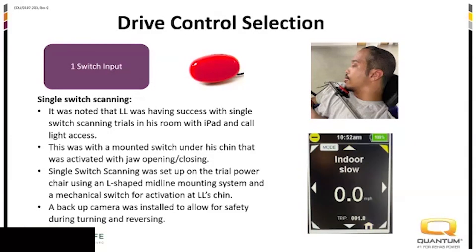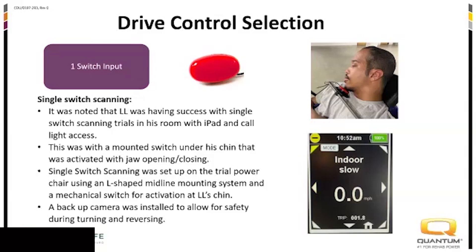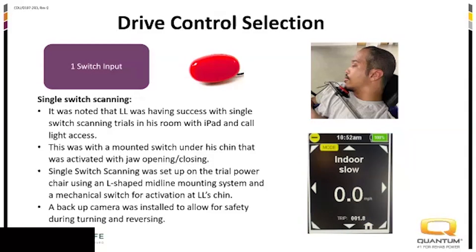We initially mounted — you can see that gray bar that comes out underneath there — a switch there. You can see on the screen what the display looks like with all the different arrows: the scanning display. So when the arrow highlighted yellow, he would hit his switch to go that direction. We did latch forward. Initially he was not driving with latch, but his jaw got really fatigued holding it open, and he also just didn't like driving with his mouth open going down the hallway.